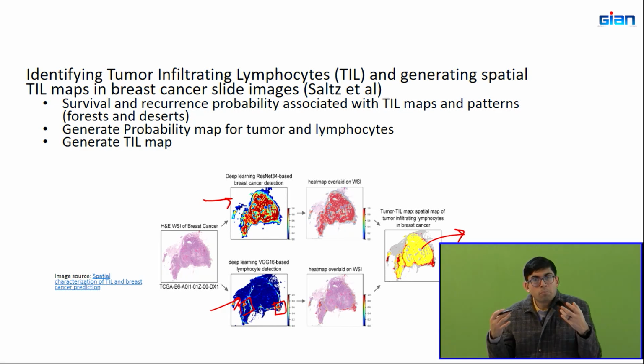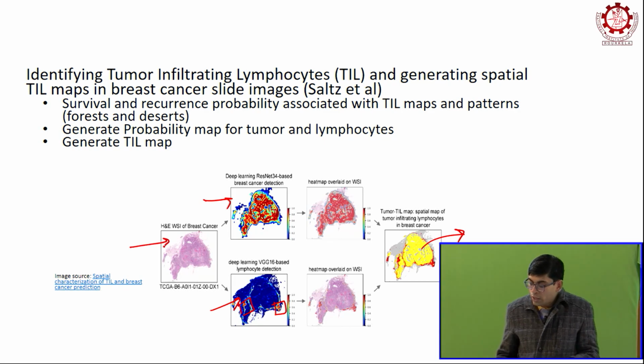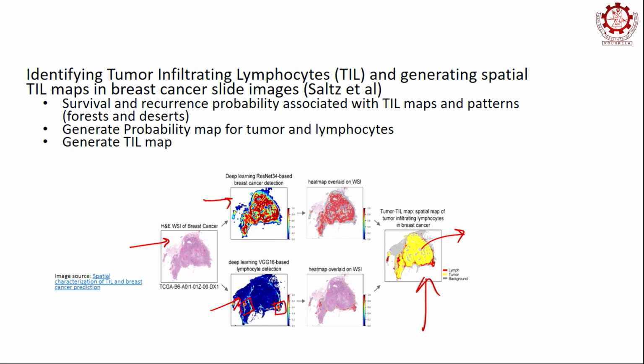So you can perform this analysis, and in addition to showing the pathologist the image, you can also give them this map. Yes, they can look at TILs, but they obviously cannot come up with a map like this immediately. If you give them a map like this, they can look at the red regions and verify first of all whether it is correct or not.